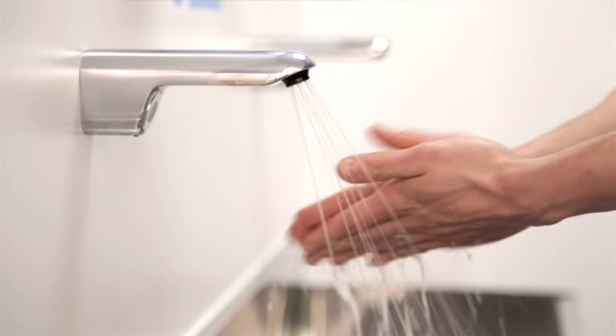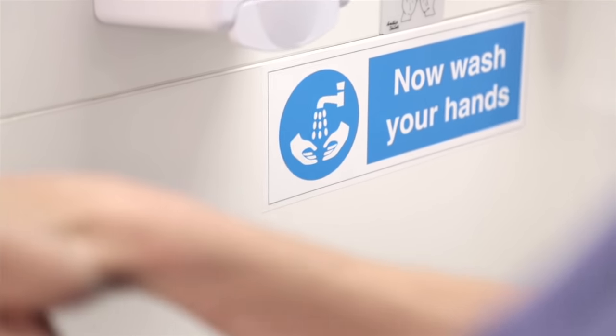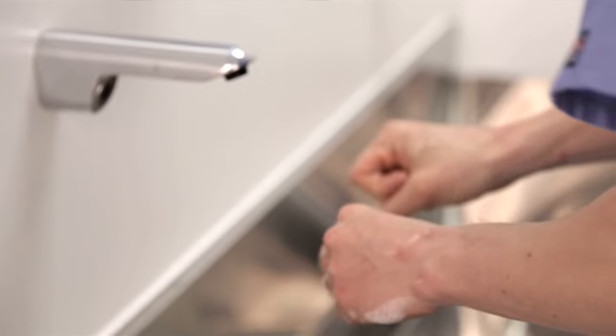My name is Dr. Andrew Smith. I'm a medical practitioner here at Good Skin Days. Today I'm going to demonstrate one of the most popular procedures done in the clinic, which is the removal of a mole.